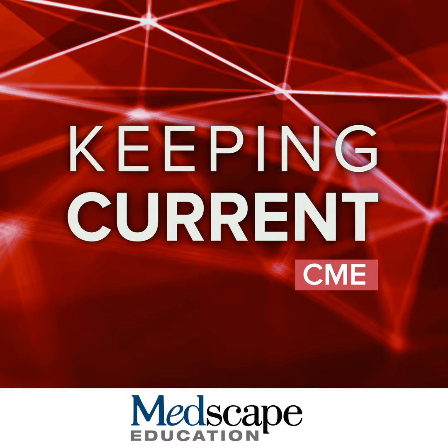This abstract's going to be presented tomorrow night. I'm not going to give you details here, but just to say that this was a translational study looking at the feasibility of even doing this prospectively. So patients were enrolled and got a same-day ultrasound and abbreviated MRI with a hepatobiliary phase AMRI. This study never met power. COVID really affected the study. But in the subset that we had, the sensitivity was increased using hepatobiliary phase AMRI, and the positive predictive value was better. All other statistics were pretty much the same.